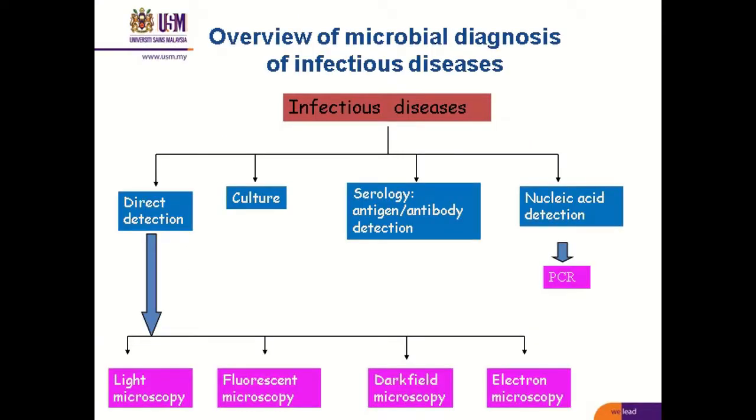As a brief overview, when clinicians send samples to the microbiology lab to identify the microorganism causing infection in their patients, we can identify the microorganism through various methods such as direct detection, culture, serology, and nucleic acid detection.